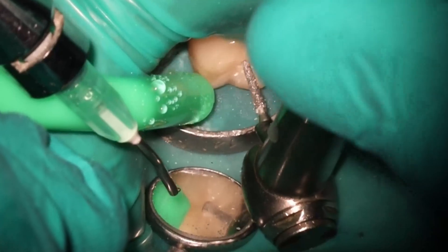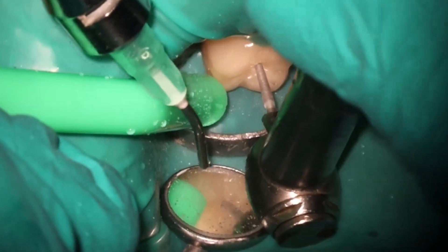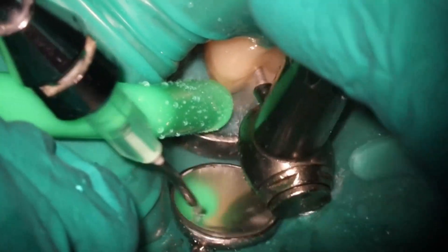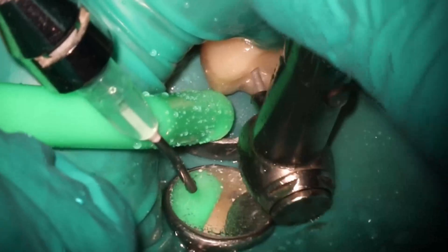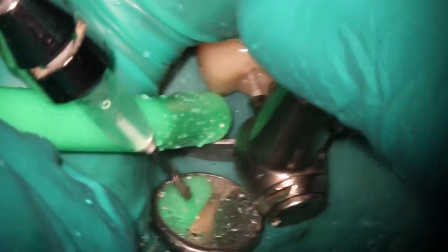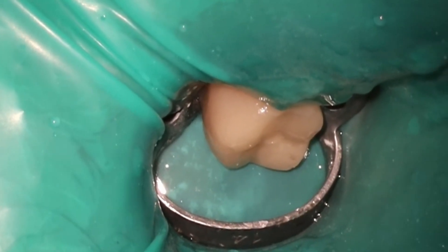When you learn how to access GentleWave initially — at least back when I learned a few years ago — they wanted you to be a decent size, about two, two and a half millimeters. Based on what I've seen with this new clean flow, similar to the anterior one, you do not have to remove quite as much tooth structure and you don't have to open it up quite as much.